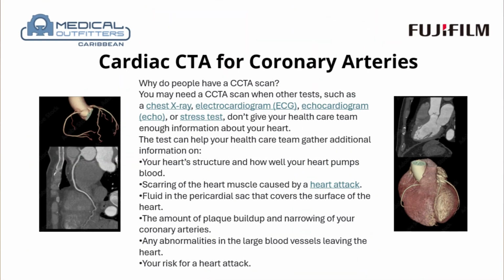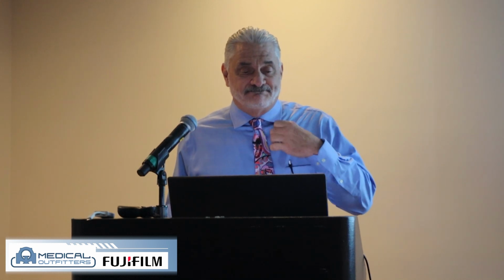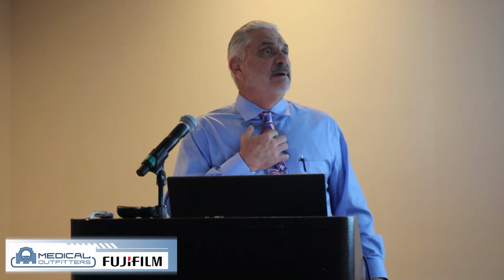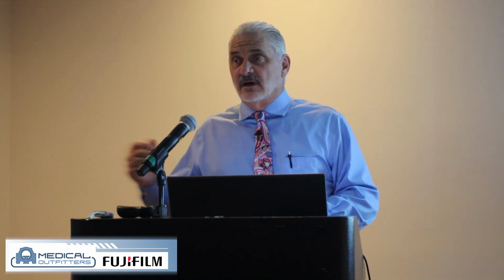So why do they have this done? It's not just because they have a high calcium score. It could be that other exams were non-conclusive, maybe a nuclear scan that was non-conclusive, or maybe they had a previous heart attack, or maybe this is a follow-up post-CABG for graft patency. All of those things can be done at the same time.